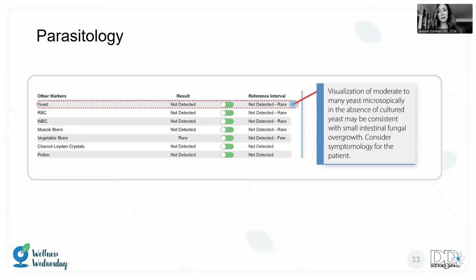Charcot-Leyden crystals are associated with parasites, just so you know. Pollen can also be in the stool. Not frequently, but very infrequently can be associated with just allergies or what the patient is being exposed to.